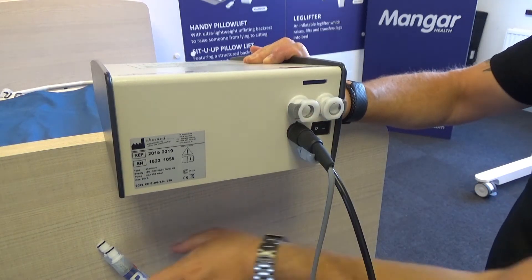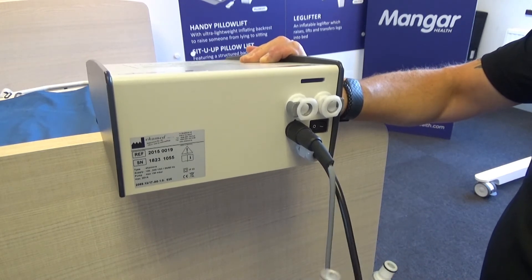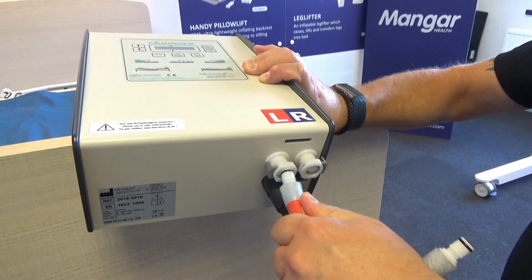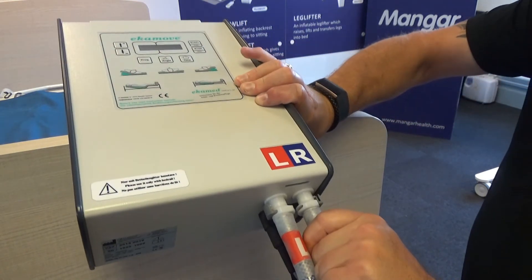On the underside of the control panel there are three sockets. Attach the sensor lead to the black socket and the air tubes to the blue and red sockets. The power on/off switch is also on the underside of the control panel.